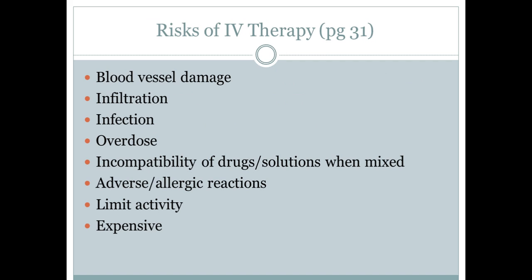So very important that when you are starting out, once you advance that needle, you're not going in and out, still staying within the vessel, but moving that catheter around or changing angles. You want to be very careful with that because you could be poking and damaging. Another complication would be infiltration as well as infection.